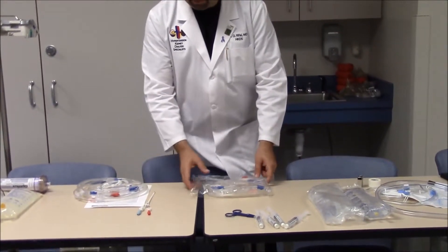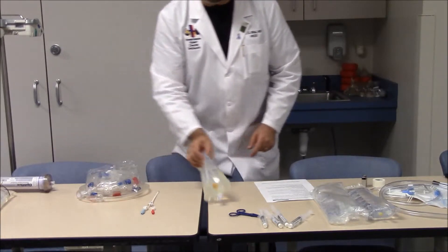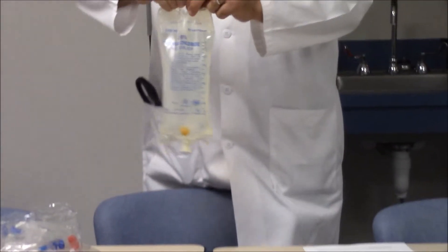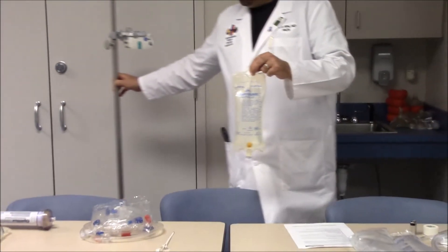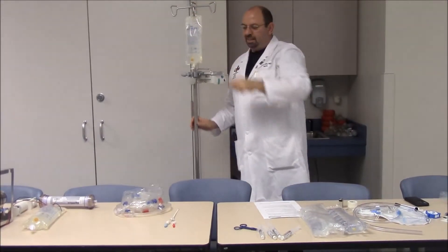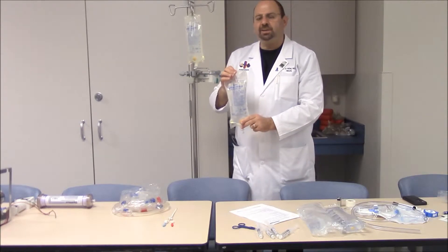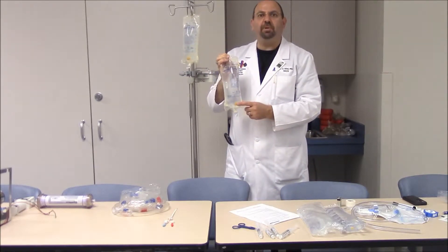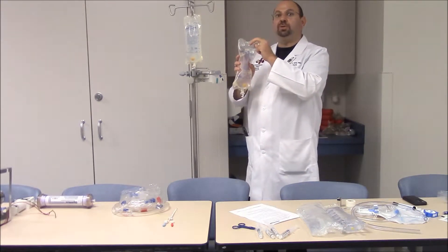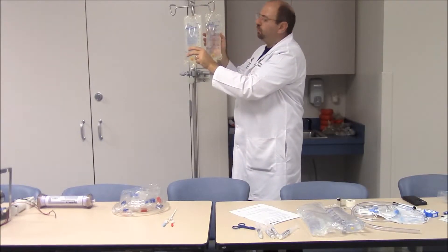The second essential item for CVVH is IV bags. The first bag is pure normal saline, which we hang on the IV pole for priming. The second bag is also normal saline for priming, but we must add 1,000 units of heparin to this bag. So bag number one is pure saline, and bag number two is normal saline with 1,000 units of heparin. Number them clearly — bag one first, then bag two.